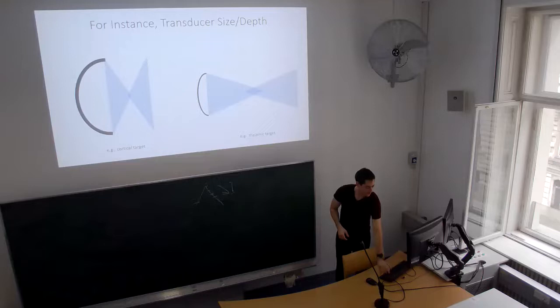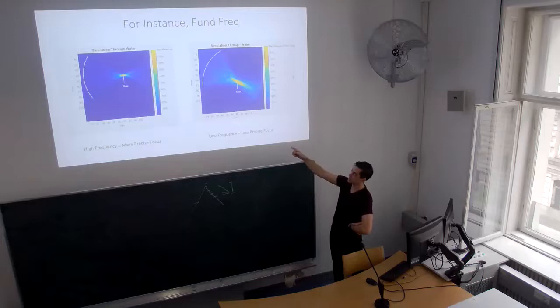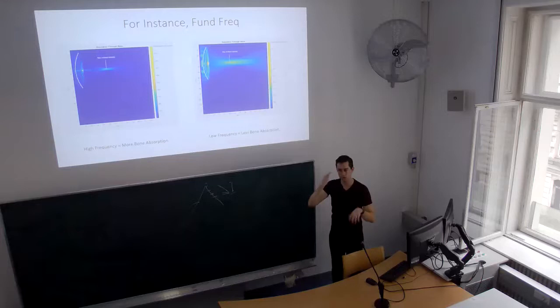Also, the frequency that you use matters. It's not something you have to think about much because it's fixed by the transducer you buy, but it's good to know. If it's a higher frequency, it's more of a local focus. If it's a lower frequency, it's going to be a wider focus because the wavelength is larger, so the interaction will be more diffuse. But interestingly, higher frequencies don't go through the skull as well as lower frequencies. So there's this balance. Diagnostic ultrasound uses something like 2 megahertz, or one to 10 megahertz. But for this, we have to use something like 500 kilohertz. So it's this in-between thing. Just throwing that out there for anyone who might be interested.